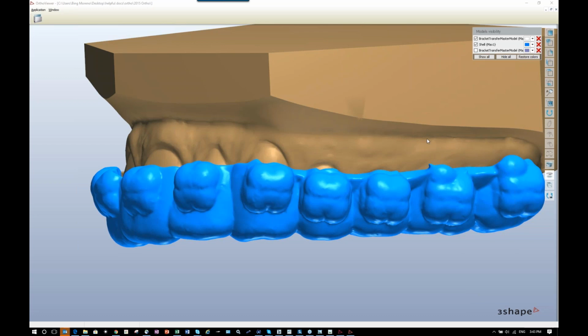All right, let me just open the questions. So, is Damon 3MX available in 3Shape? Yes, all kinds of Damon 3, Damon MX, Damon Q, and Damon Clear will be there. And how do we allow for custom bases? Once you have the software, the bracket placement will allow you to create your own base.